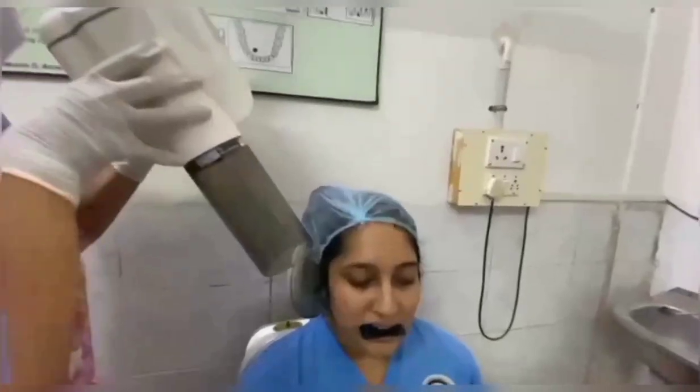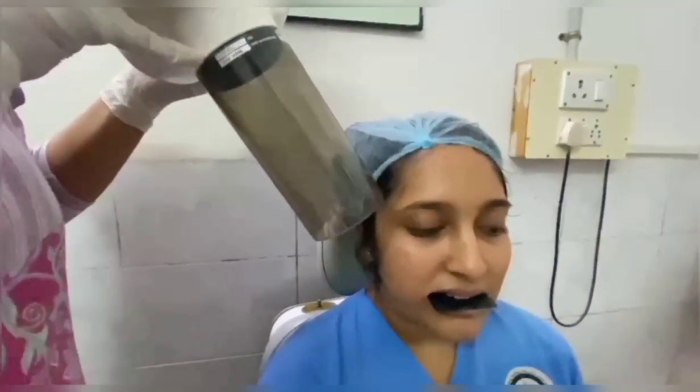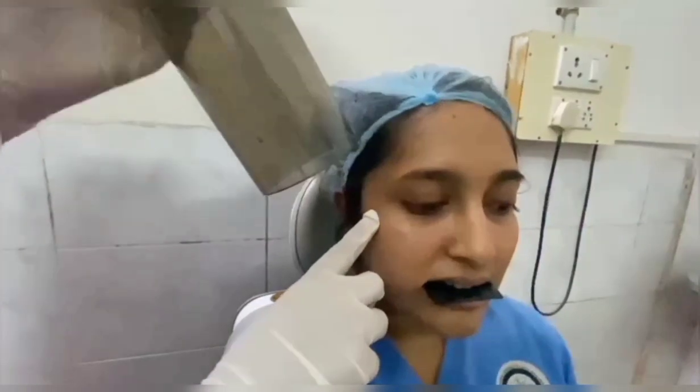This projection shows half of the alveolar ridge of the maxilla, infralateral aspect of the antrum, the tuberosity, and the teeth from the lateral incisors to the third molar. It may also show the zygomatic process of the maxilla superimposed with the roots of the molar tooth.